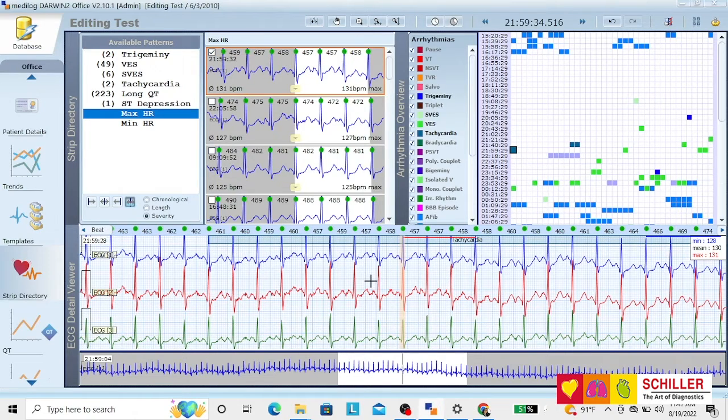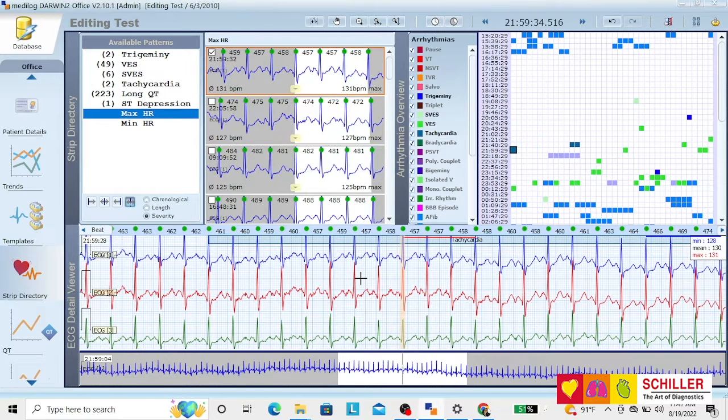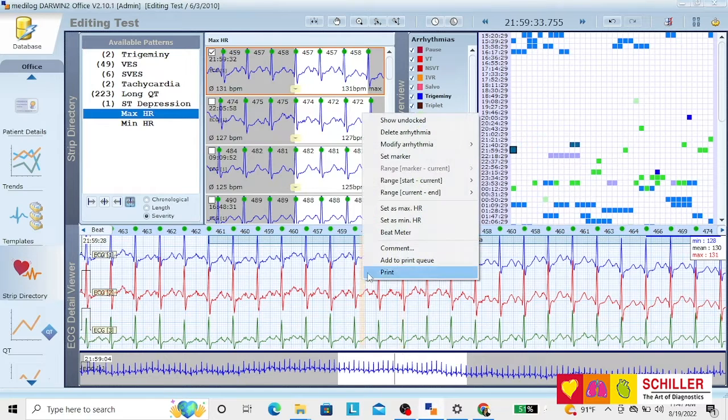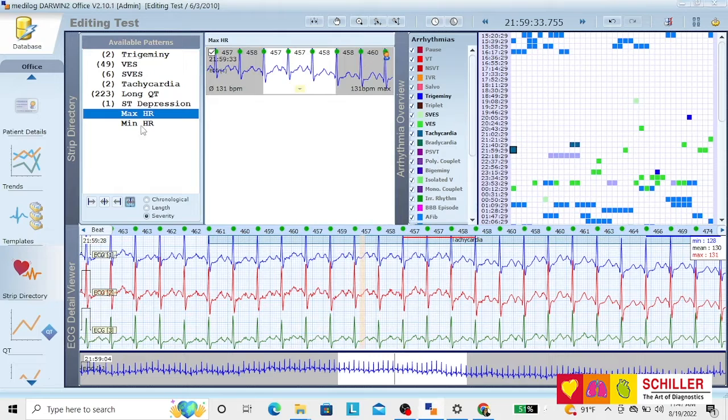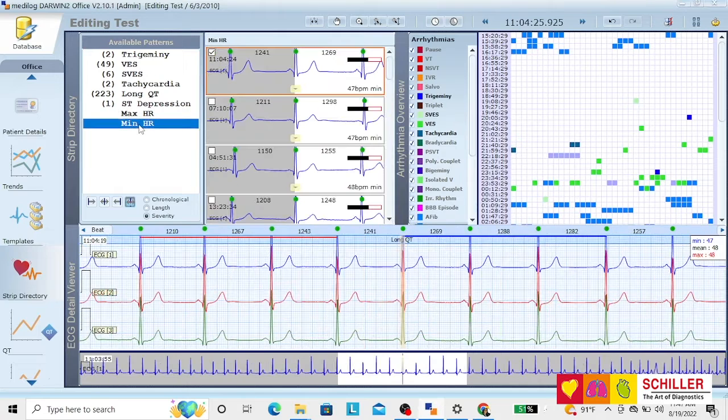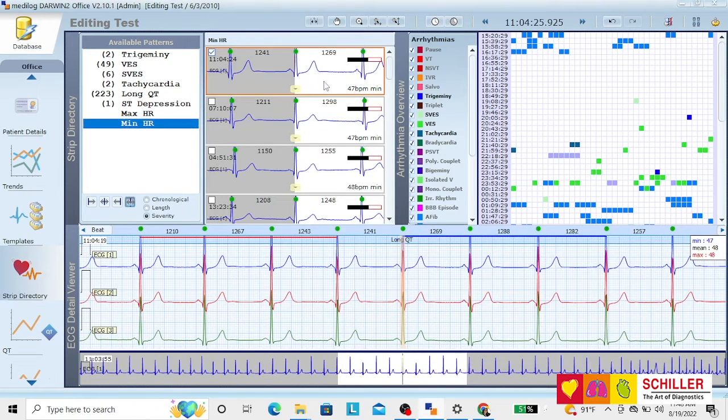This is really the maximum heart rate. Go down to the strip, right-click, and set as maximum heart rate. Same thing with minimum heart rate.